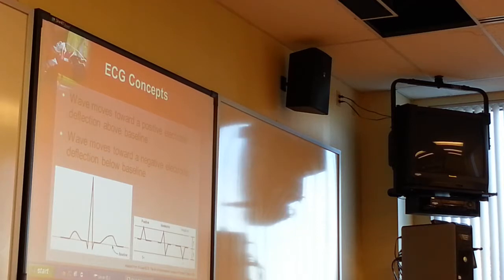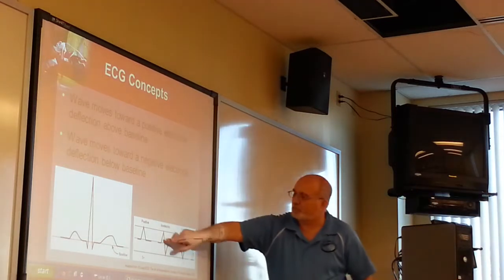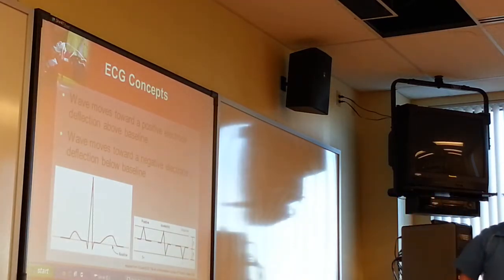So positive, normal, isoelectric, positive then negative, and then we have truly negative. Questions?